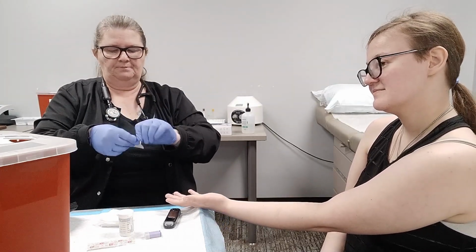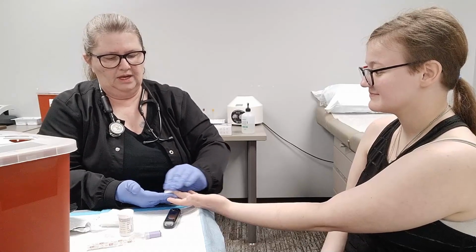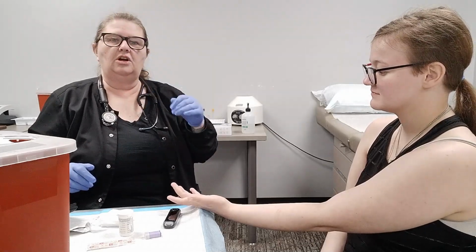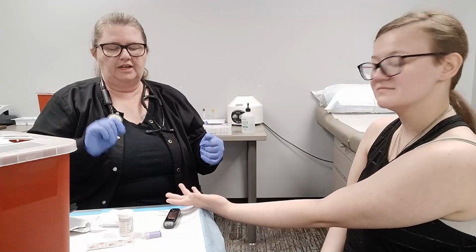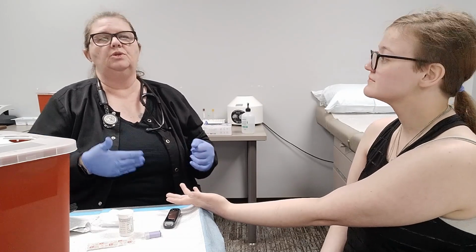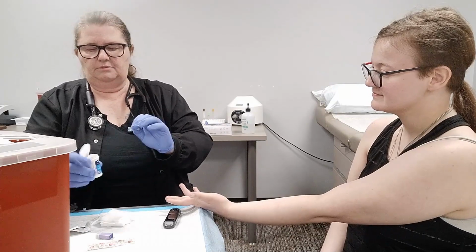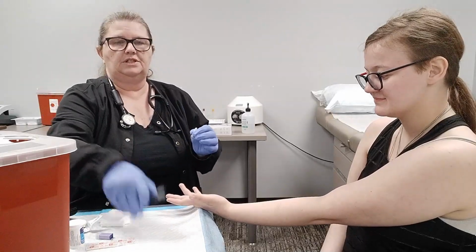So we're going to go ahead and get the alcohol prep pad and clean that area. Now, I'm sure you're going, wait a minute, you haven't put the strip in yet. No, I have not, because if you put the strip in and leave it for too long, it will actually shut off. While I'm waiting for that alcohol to dry, because you never want to puncture the skin with wet alcohol, it'll push the alcohol into the wound and it stings, and we don't want to do that to our patients, this is when I get my strip out and put it in the machine. That way, there's plenty of time for the alcohol to dry and plenty of time for this to get going.